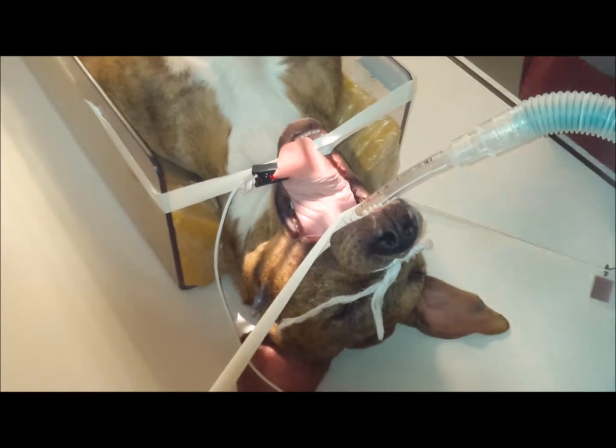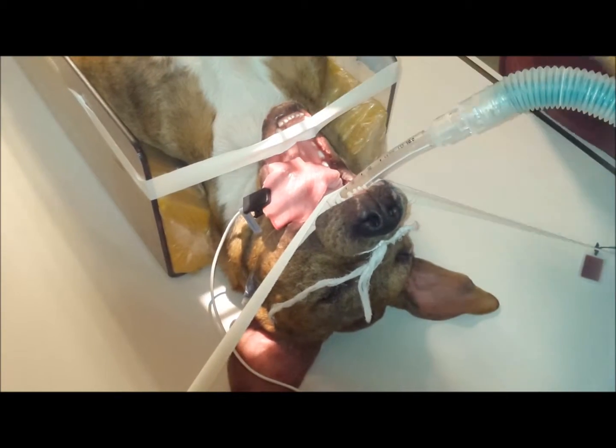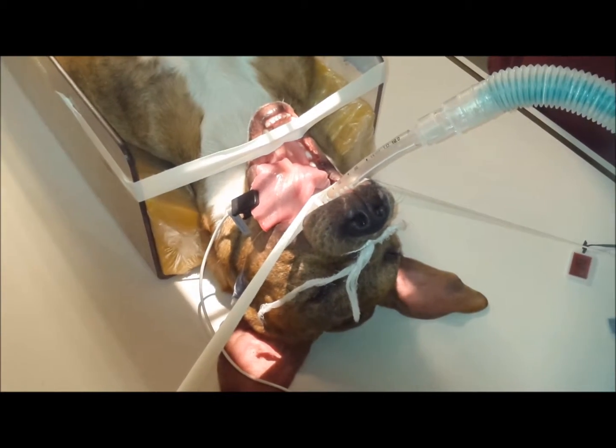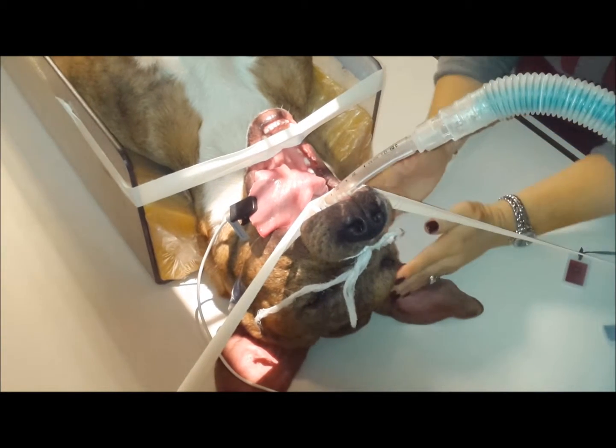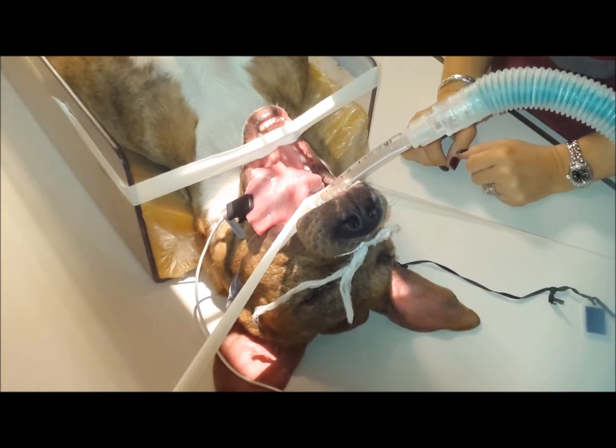Center at the back of the mouth. Make it the width of the head, and just from mandible to the top of the head.